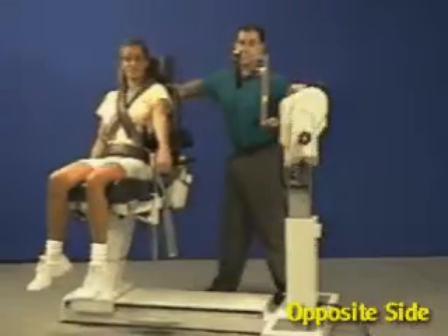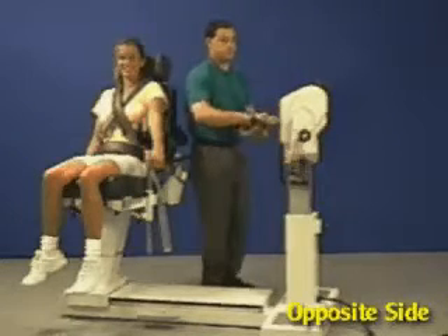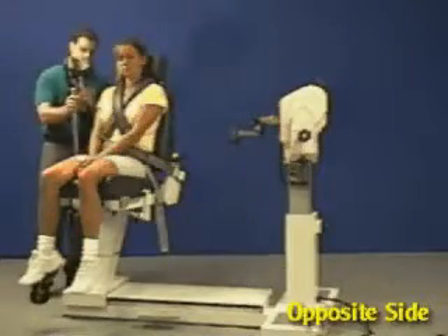Slide chair back. Remove fixture and rotate 180 degrees, remembering to align the red dots. Move limb support to opposite side of chair.